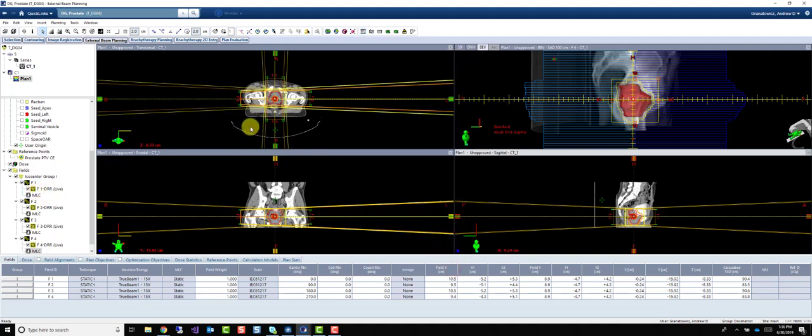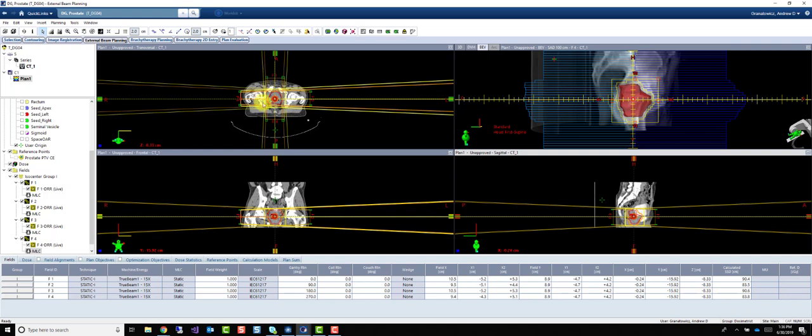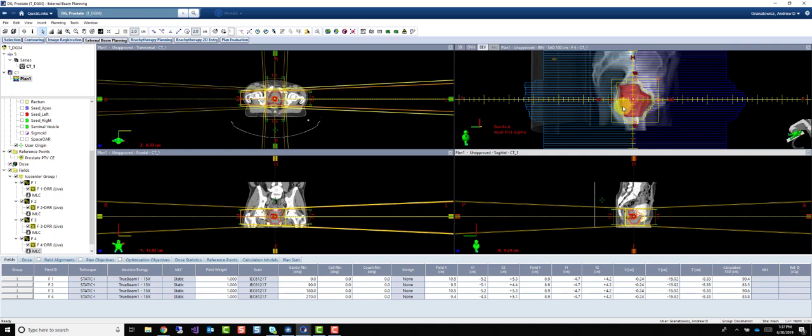So we have our four fields. It's called a four-field box technique or standard four-field technique because we have our AP beam, our PA beam, our right lat, and our left lat all equally spaced, all with the same margin.